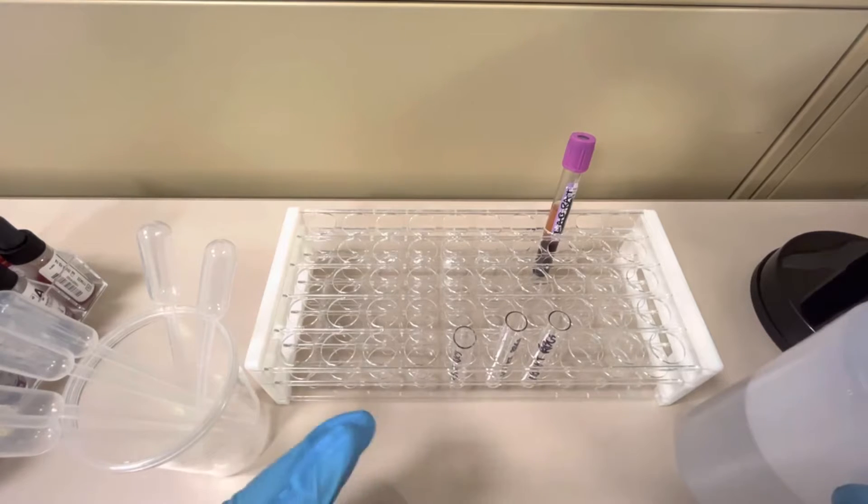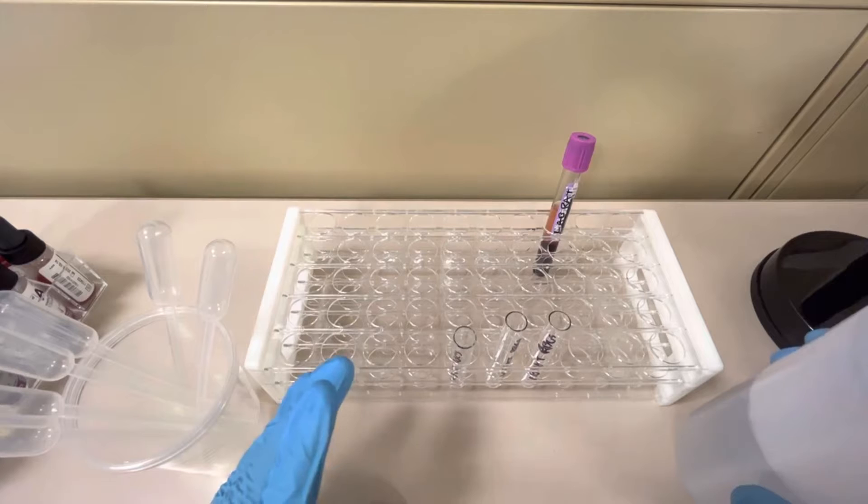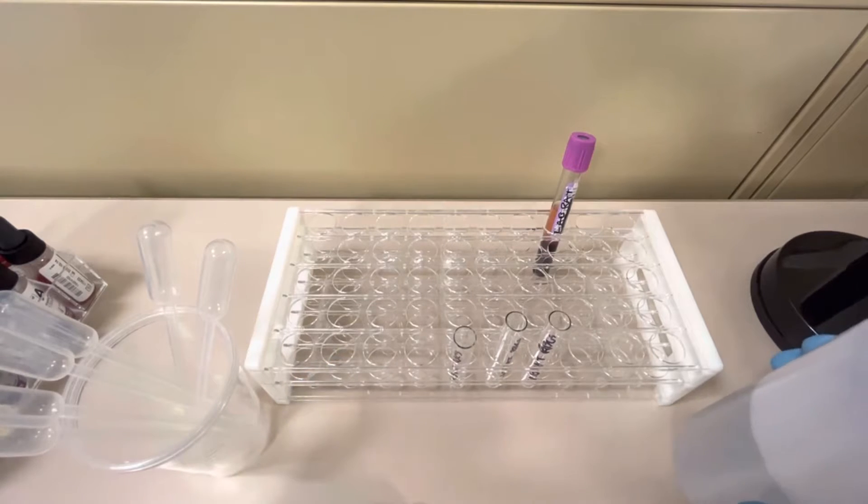So we can't just put straight red blood cells into reagents. We need to dilute it with saline first. The proper suspension is usually around three to five percent. I usually try to shoot for three percent.